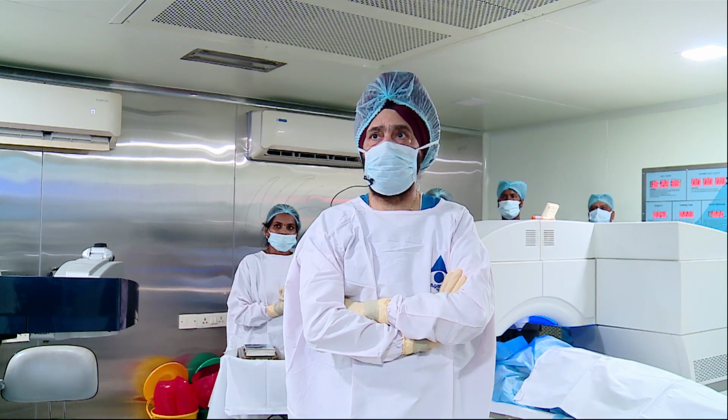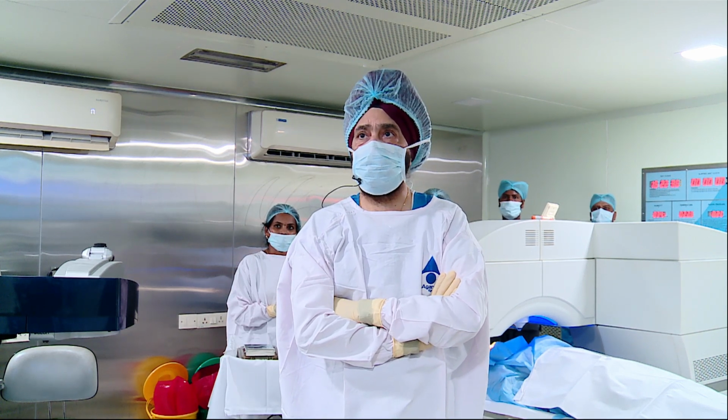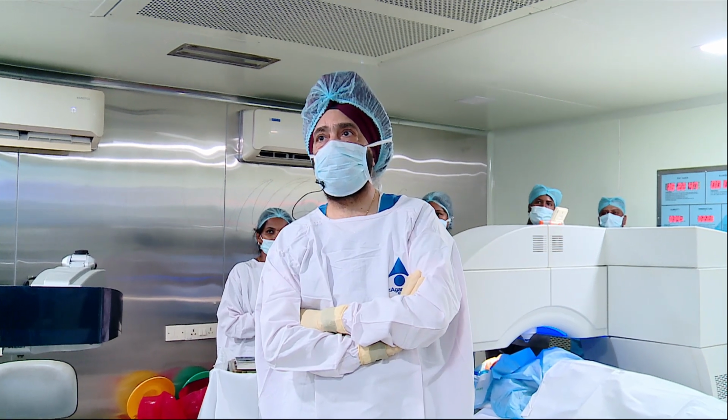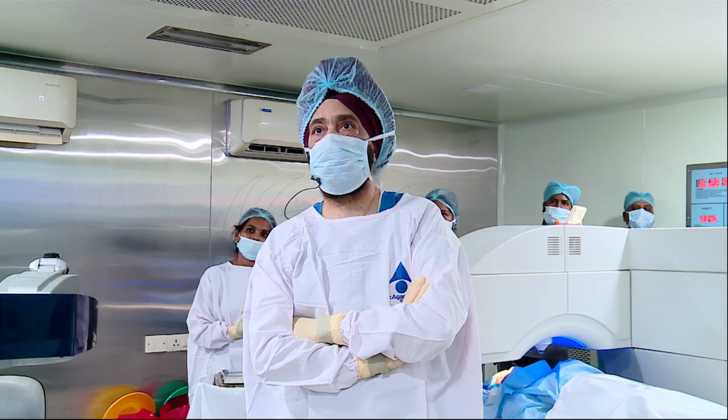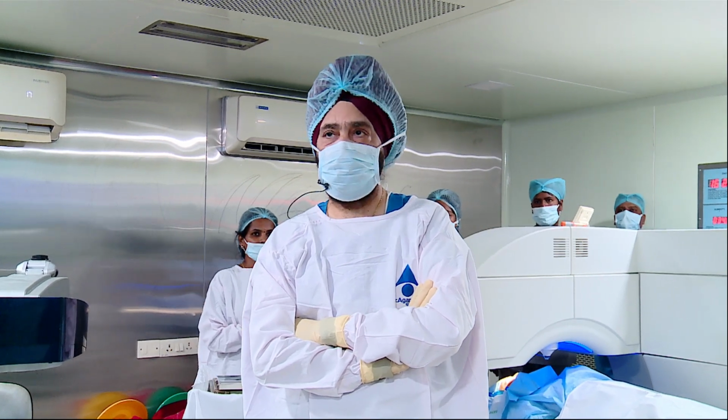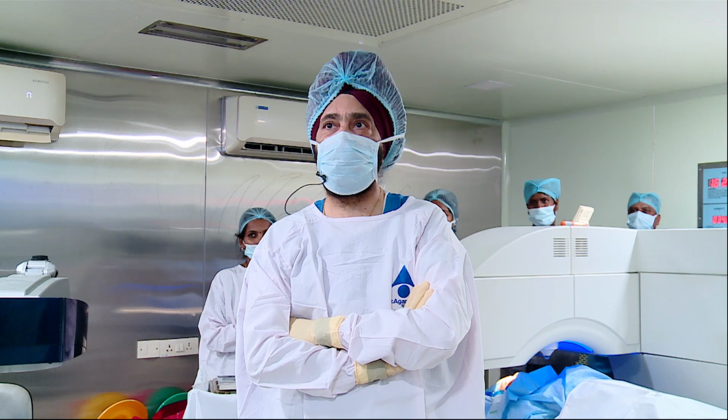Thank you, Dr. Mahipal. Wonderful surgery. Any questions? What is the upper limit of cylinder where you would not do a SMILE when you do femto contoura? The question is for Dr. Tital or for me?